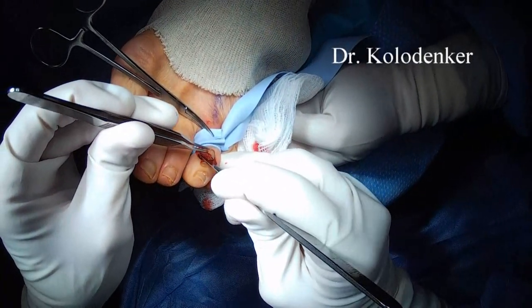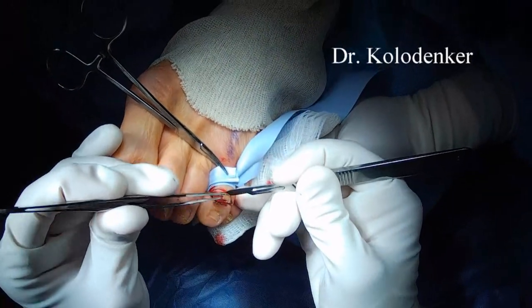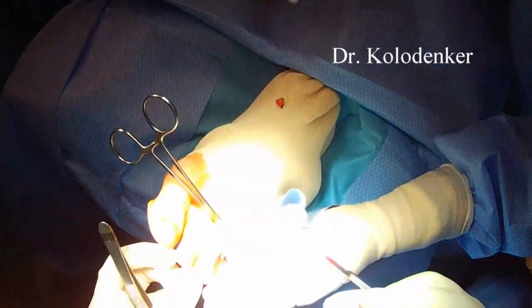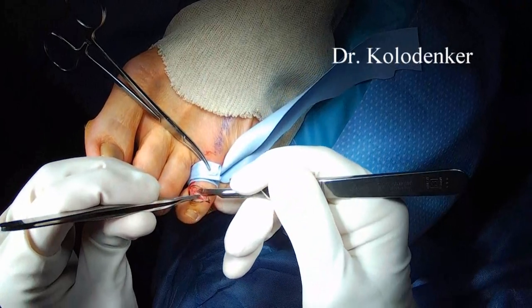This goes all the way down to the joint, so it is ideally done in a surgical center environment rather than an office to decrease the chance of infection. Antibiotics are typically given preoperatively before the start of the procedure to minimize the chance of postoperative infection.